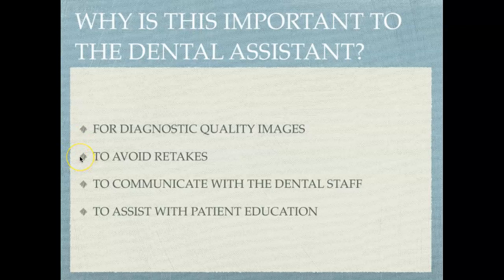That allows us to avoid retakes. So we are practicing ALARA, as low as reasonably achievable, for our patients. And it allows us also to communicate with the dental staff in regards to patient treatment and patient cases.